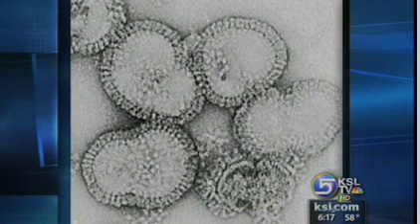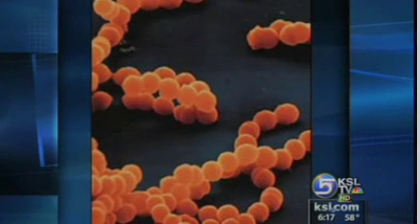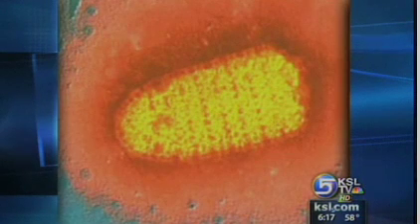Potential pandemic diseases like avian influenza or drug-resistant strains of streptococcus and staph infections. At the level of the doctor's office, a point-of-care device permits a diagnostic test that previously would take several days to be done while the patient waits, and then actually the patient could receive treatment at the same time.